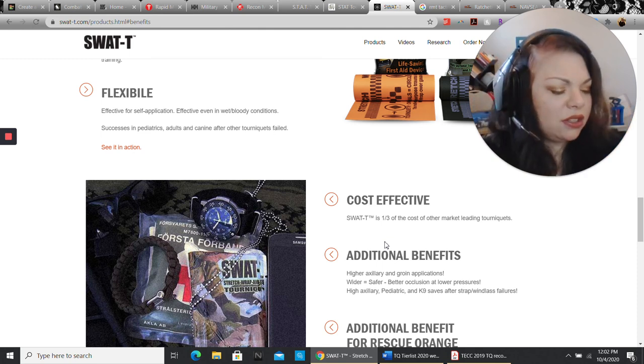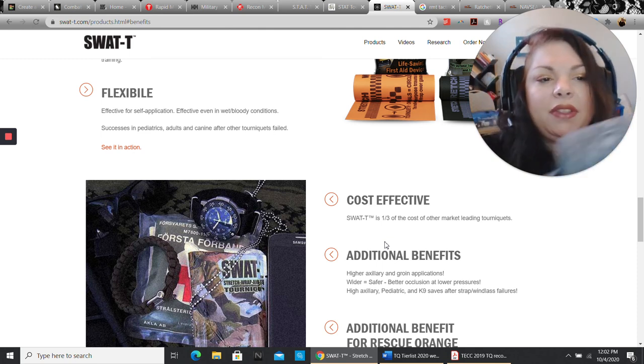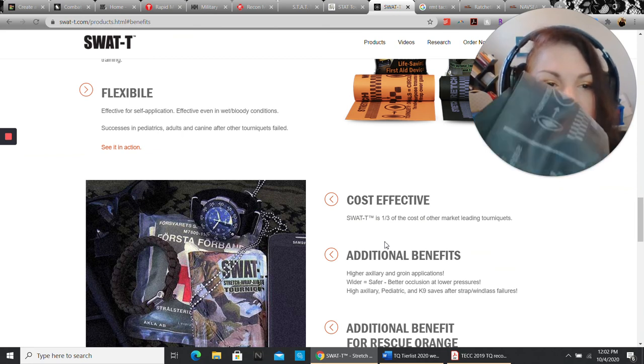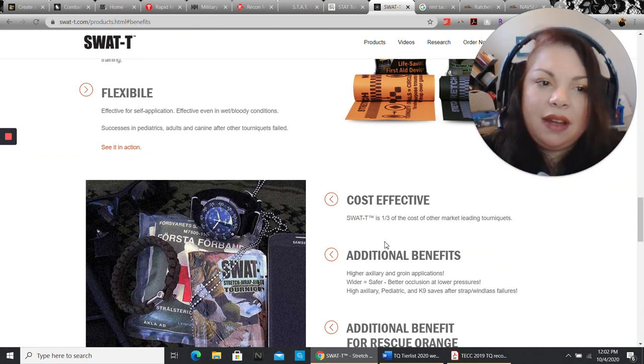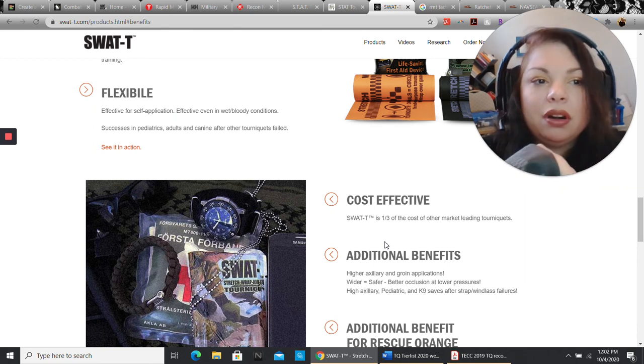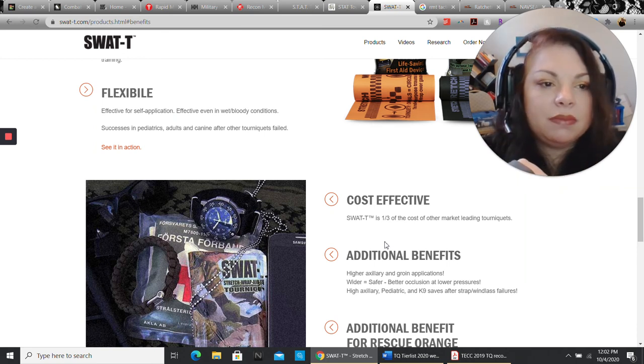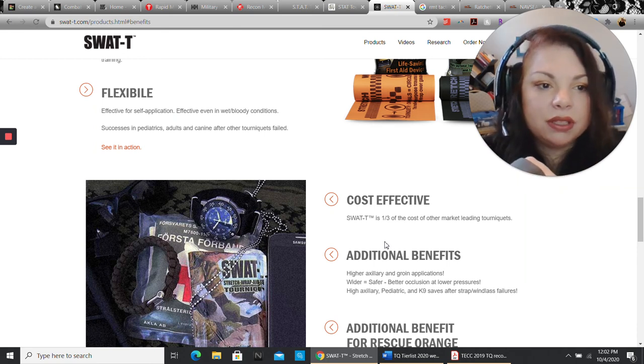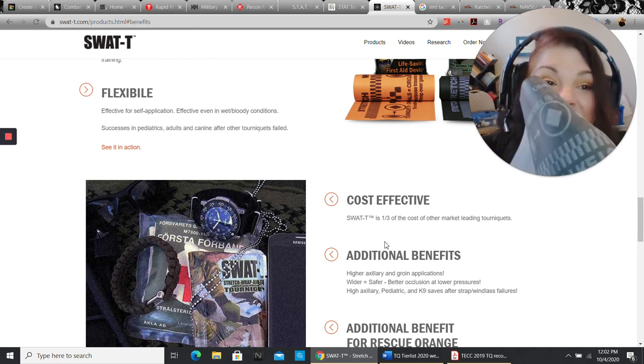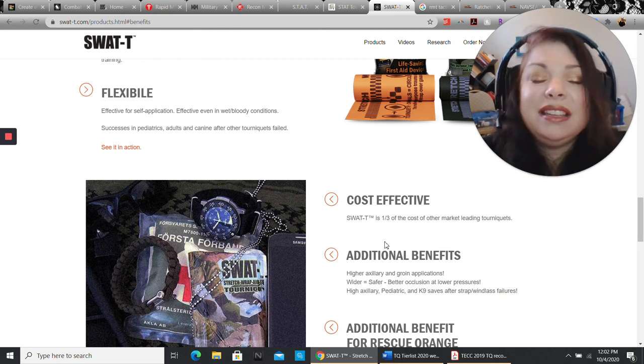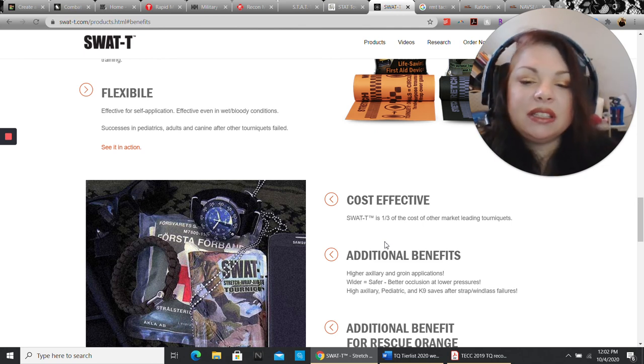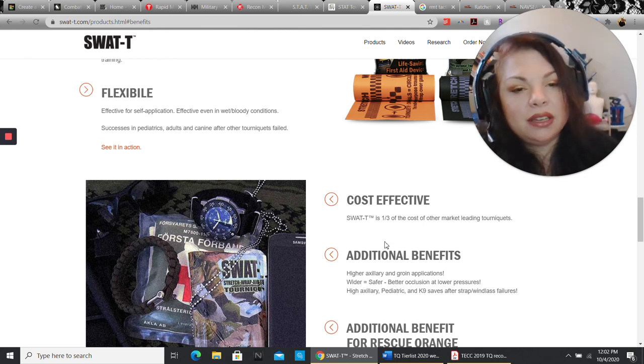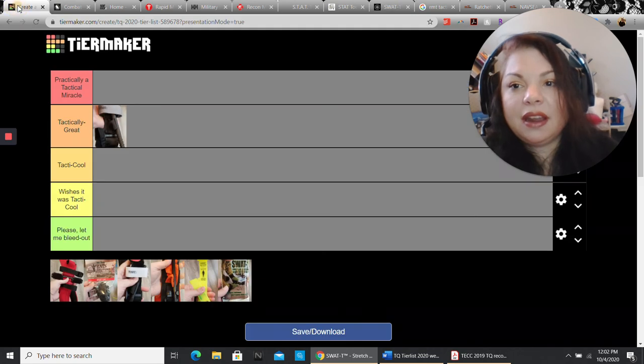This is really good for people who are in an environment where they have to pack something that will work but they don't have a lot of space. Or if you really operate under the ounces equal pounds and pounds equal pain principle, this thing is really great. It's super light, compact, easy to carry. So it does have some really great benefits.